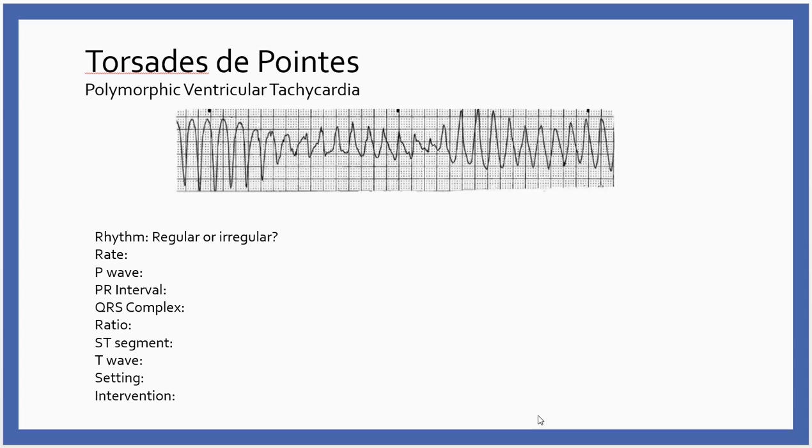And then, like I said earlier, there are some over-the-counter antihistamines, cold medication, and then some prescribed antibiotics and tricyclic antidepressants that can prolong QT interval and put them at risk. So you see this on the monitor. Annie, are you okay? You've got to assess your patient. If they are still conscious, we're going to consider magnesium. Typically speaking, when you see this, your patient is dead.